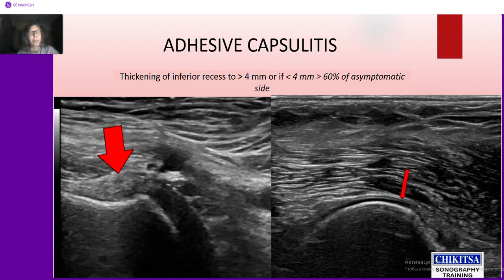If you have to look for it posteriorly, just as Bill mentioned, you look for the posterior recess. And if you find thickening of soft tissue similarly there, or if you find that the movement of the infraspinatus during external rotation is not smooth, but appears jerky, or if the tendon is getting pulled down towards the labrum, those are signs of adhesions involving the posterior recess.